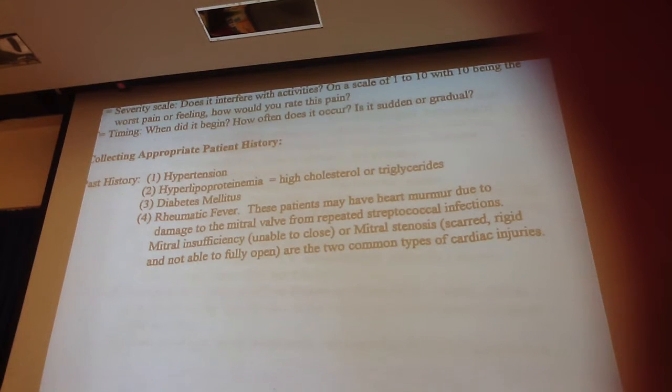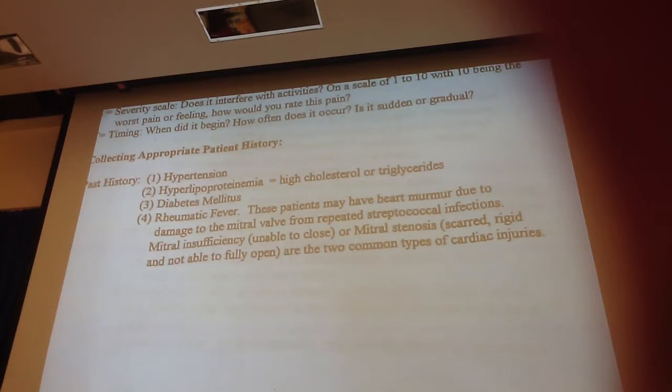So very important to get a history on these types of patients so that you know what you're dealing with, okay? Especially when you get questionable results as far as your ejection fractions and things like that. I wanted to show you what we're talking about though with this thing about perfusion and wash in and wash out with thallium.